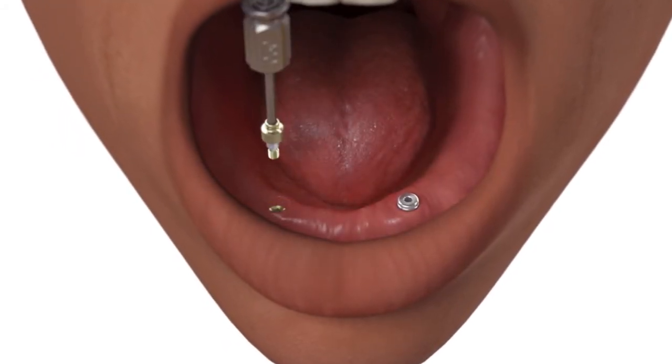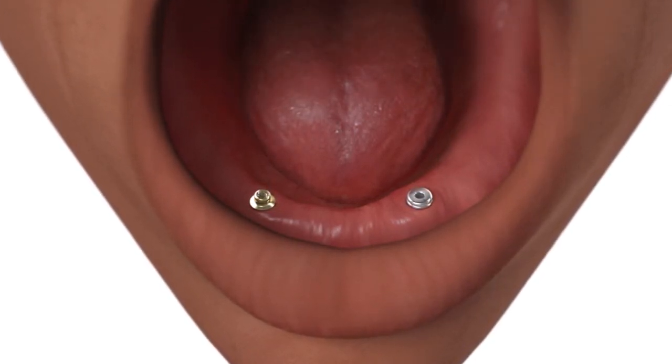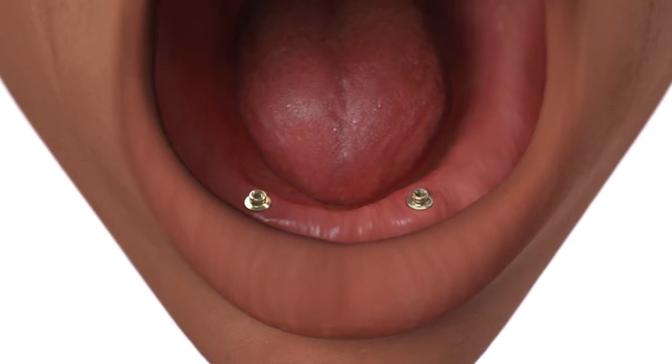Place the OD Secure abutment onto the implant body using the hex driver and hand tighten. Place each OD Secure abutment immediately after removing the healing abutment to prevent soft tissue from collapsing over the implant.